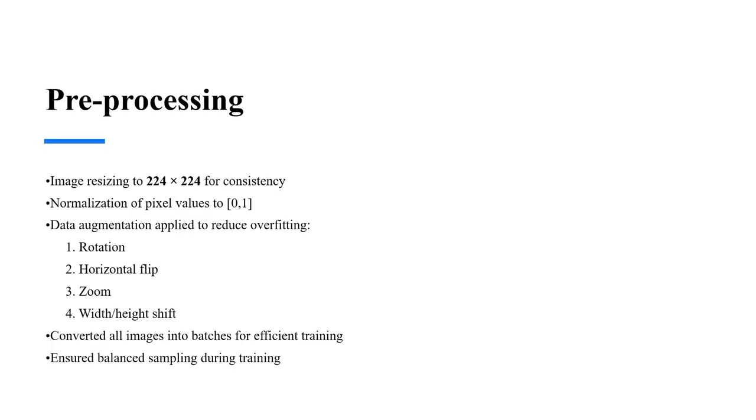Before training the model, we applied several pre-processing steps. All images were resized to 224 by 224 and normalized. We also used data augmentation techniques like rotation, flipping, zooming, and shifting to reduce overfitting. The images were batched and balanced so the model would learn better.